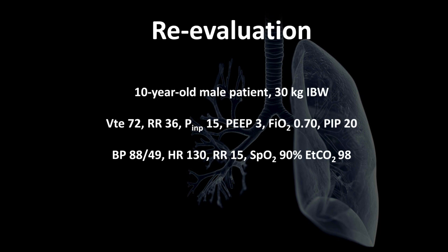So how can we use our math and our mind to both impact the expiratory phase, which we know is a factor, but also improve the inspiratory phase as well? I want you to notice that the patient is getting a tidal volume exhale, they're in pressure, of only 72 mils.